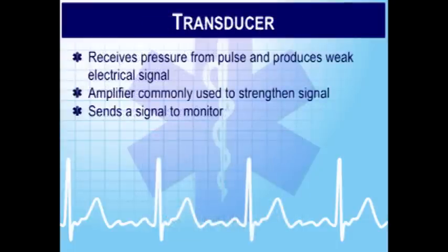So you saw, any pressure that I'm monitoring, I have to have that transducer. That's going to provide me this electrical interface between the fluid-filled vessel or chamber back to my monitor to give me a waveform and numerics. This is the transducer that does that. So whatever vessel I'm monitoring or chamber I'm monitoring, I got to have it.